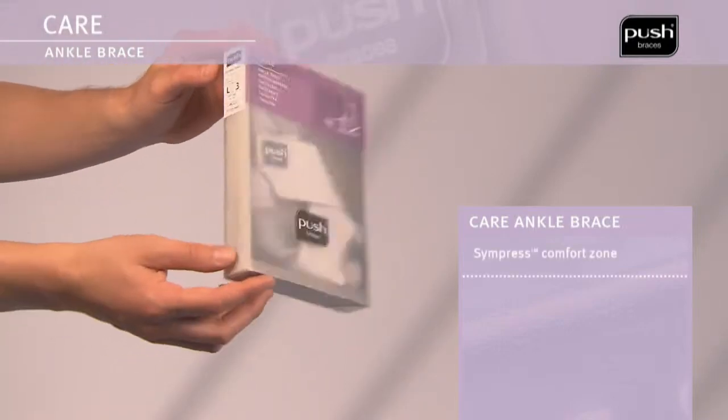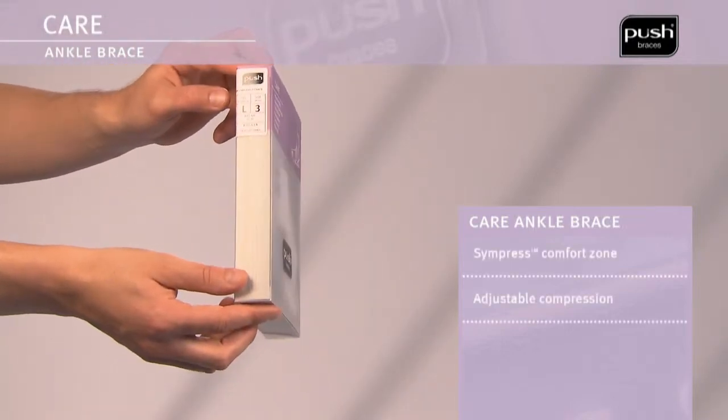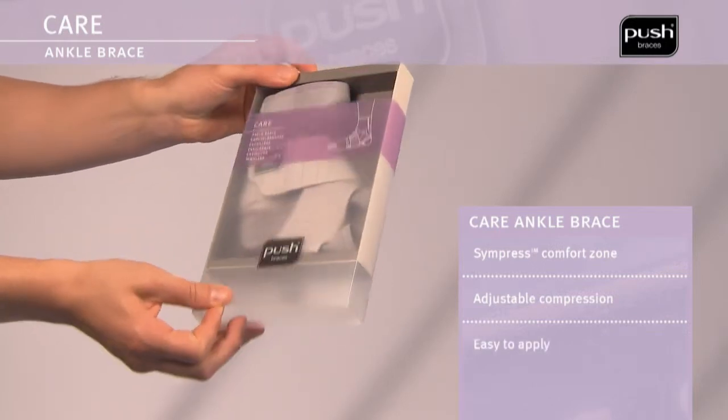The Push Care Ankle Brace provides compression around the ankle, thus improving the sense of stability of the joint.